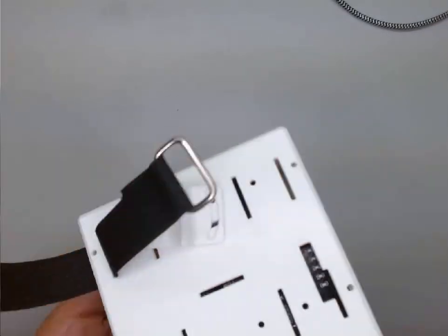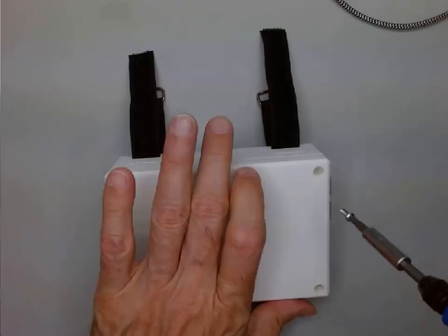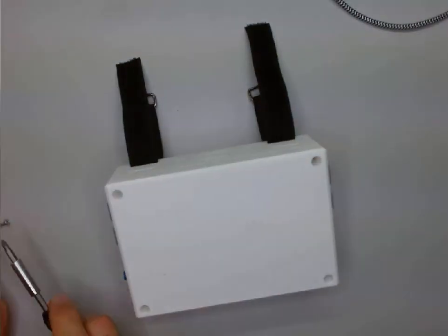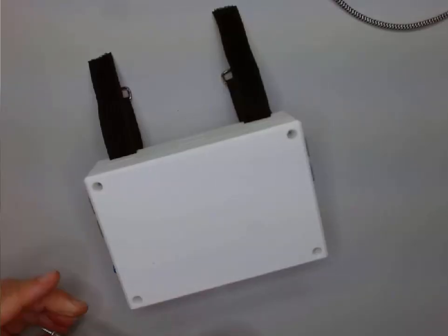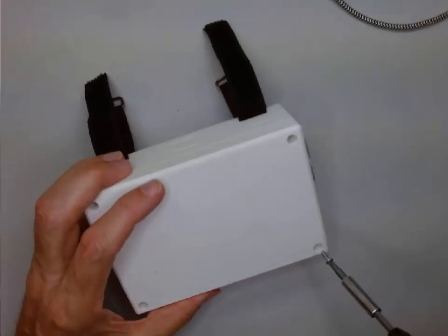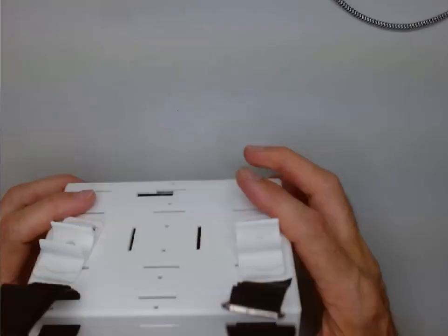And now I can put screws down into these openings on the front. And join the two halves together. This is where having a magnetic head on your screwdriver really is handy. All right, that unit is all set to be attached to the walker.